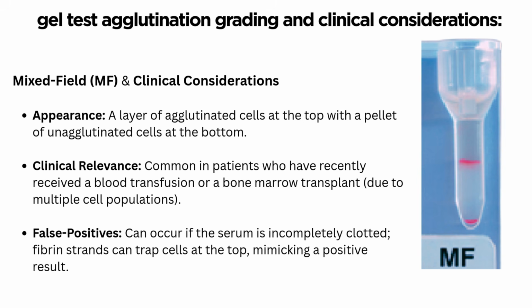So now, why is this clinically relevant? Because mixed field reactions are commonly observed in patients who have recently undergone a blood transfusion or a bone marrow transplant. Remember, these procedures result in the coexistence of different cell populations, which can affect the test results.